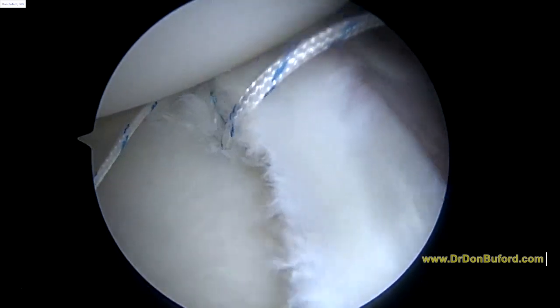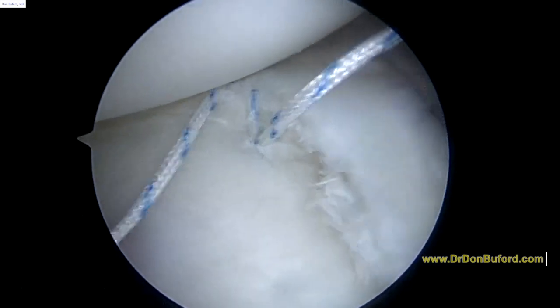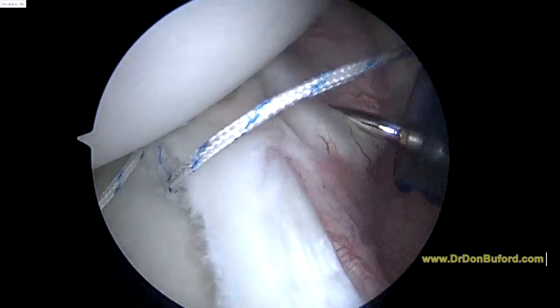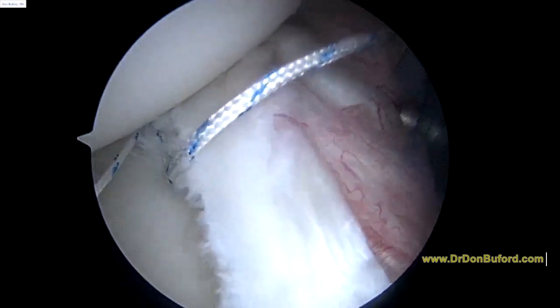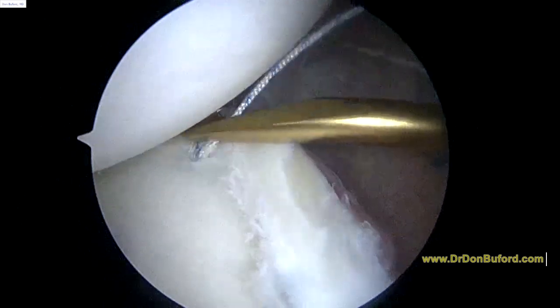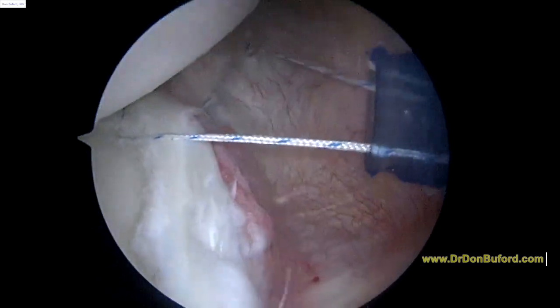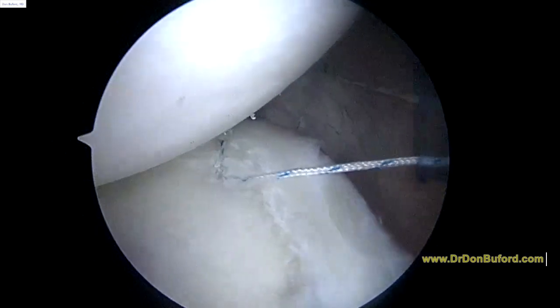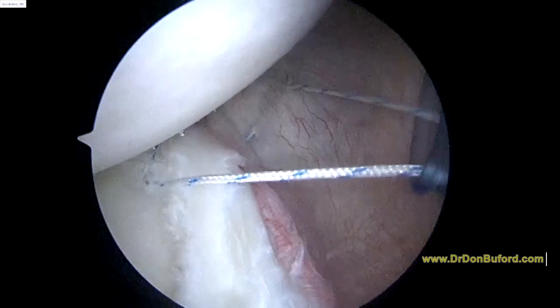Just see where we're getting through there. Take that right there. Now we're ready to tie this knot, and you'll see how it tightens and plicates the capsule and really gives us the first step in repairing this shoulder for you. We'll show you how that looks as soon as we're done here.